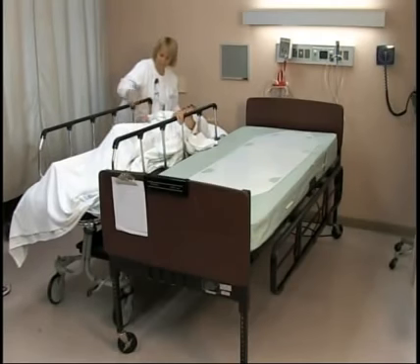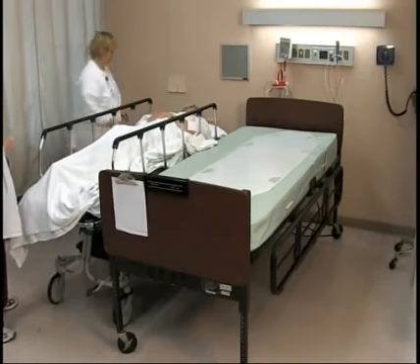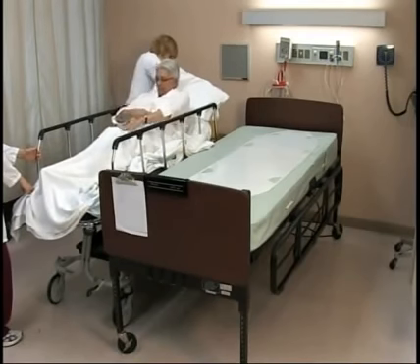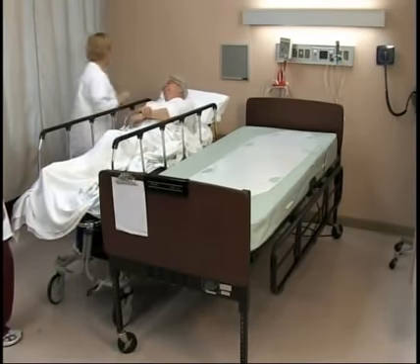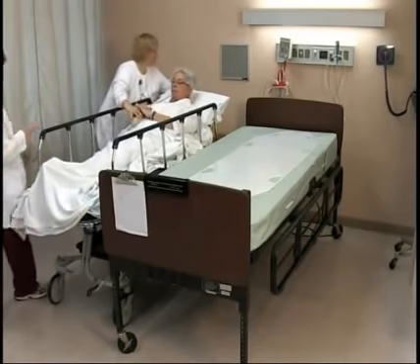Pull up the side rails on the stretcher, assess patient body alignment, cover the patient with a sheet or bath blanket, and raise the head of the stretcher according to the patient comfort and tolerance. Unlock the brakes if the patient is to be moved immediately, and if transport is coming, leave the brakes locked until transfer.